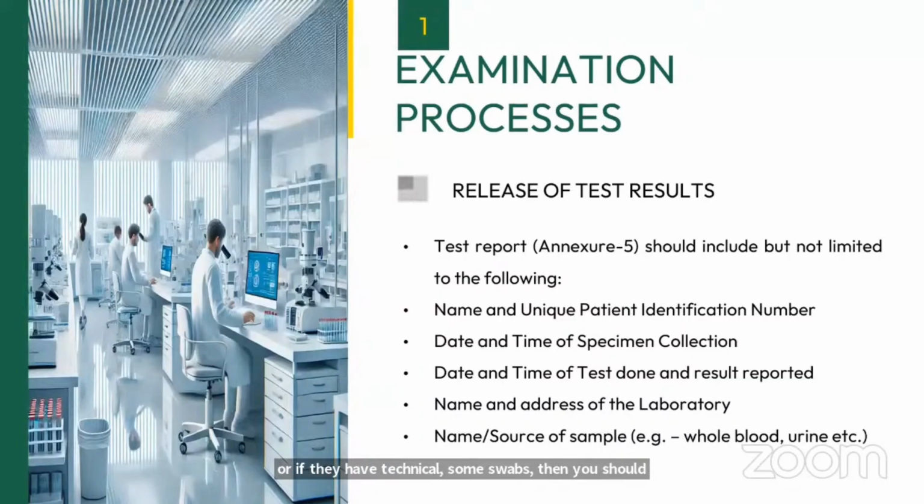Many a times I have seen some microbiological reports. Specifically, I will give an example. We are seeing reports of OT swabs. It is required many a times now for accreditation and certification purposes, regarding the sterility of your OT, your labor rooms or your ICU. So we collect the swabs and give them to some laboratories and they give us a report.